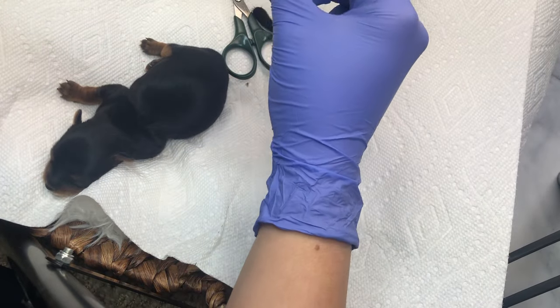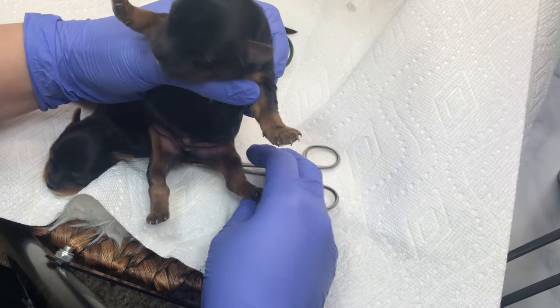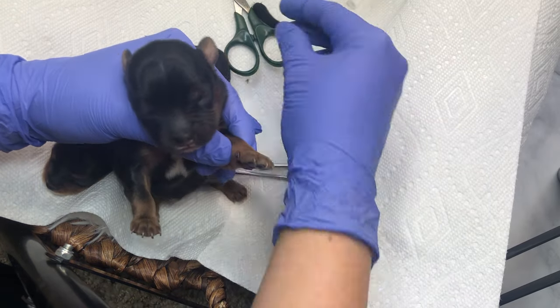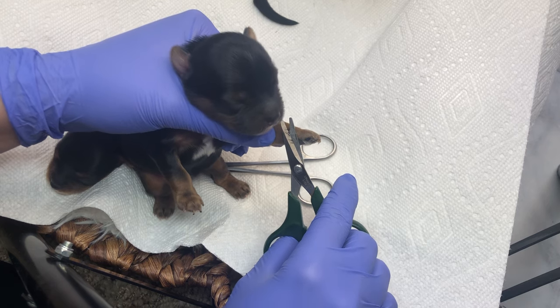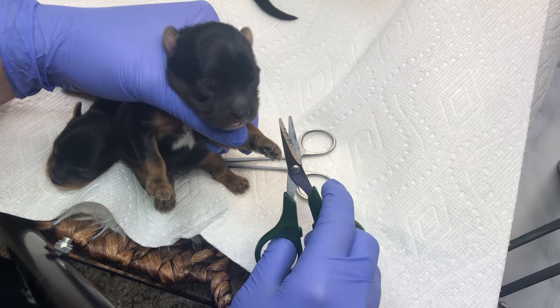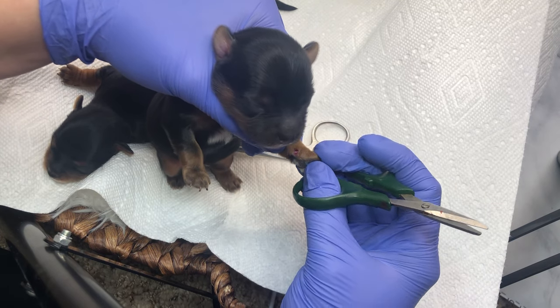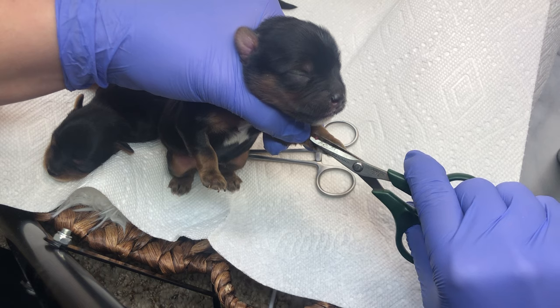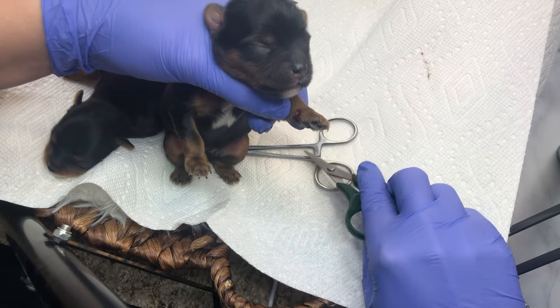I'm going to check this guy's clamp — everything looks good. I'll give that a little more time while we do one of his dewclaws. I try to pull the skin towards his body to get it tight, then just pop that off. Now you can see in there — that is the seed. I feel like that's the only part that really hurts them. That's what you need to get out to make sure the dewclaw does not grow back.